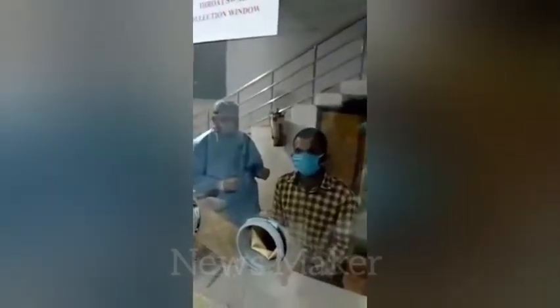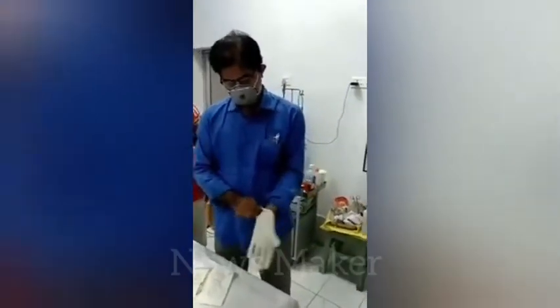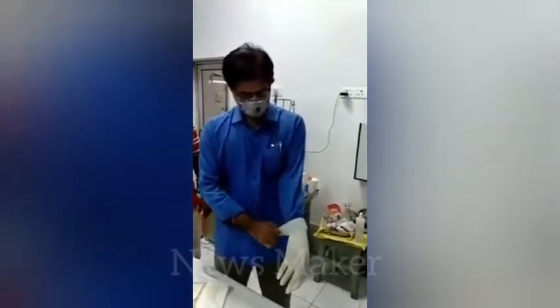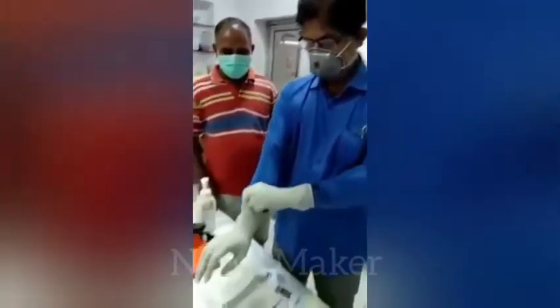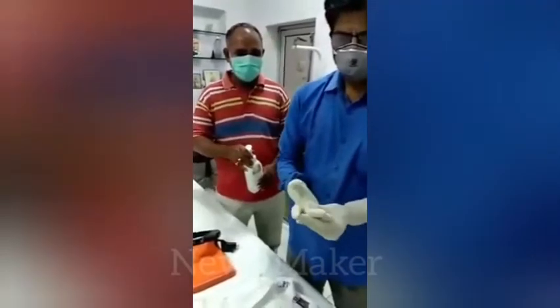This is the second case for which the sampling will be taken by Dr. Ravikant again. It's getting ready — sanitizing the hands with sanitizer.